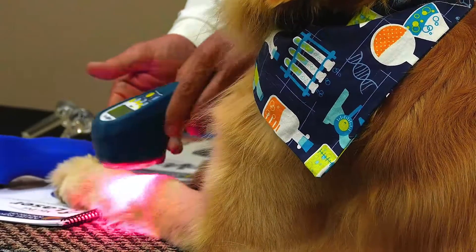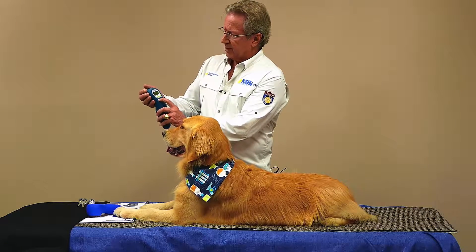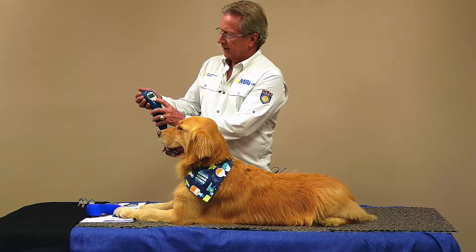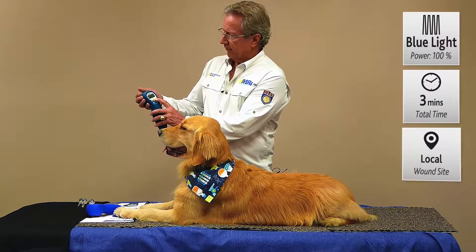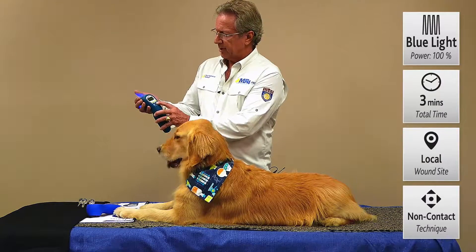Once you've scanned over this with a synergistic combination of wavelengths, press stop. Go back to your settings for Activette Pro and switch over to the blue mode. Press select, go to 100%, press select, then set your timer. Very simple — then press your start button.